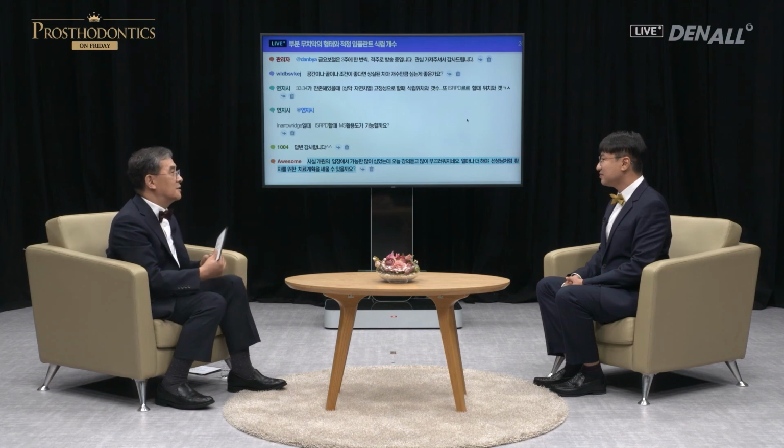Placing many implants is not an issue. It's placing too close that's a problem. We need to avoid biological problem. Also, if the space is too wide, it can lead to mechanical problems. So, placing too little can also become an issue.